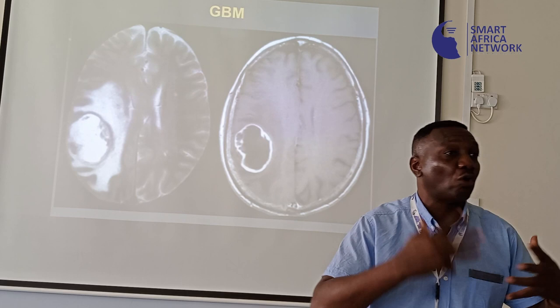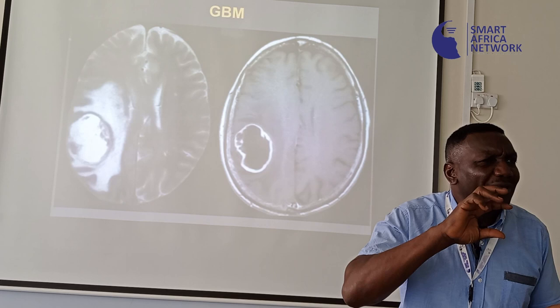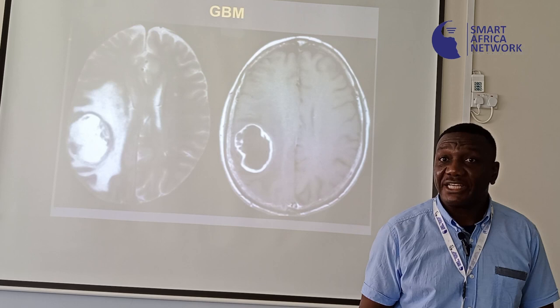So when you do that, if the lesion you are dealing with is one you don't understand initially, it helps you to what? It gives you deeper characteristics. Do you understand? So we use contrast agents sometimes, most times, to be able to understand the characteristics of lesions.